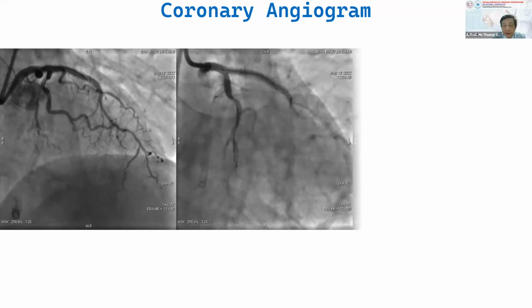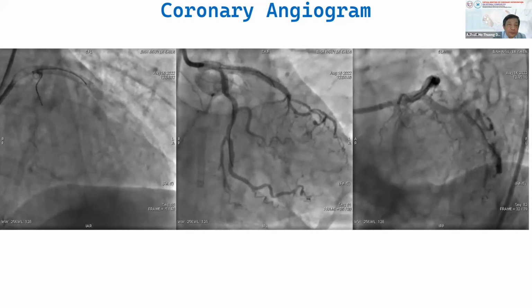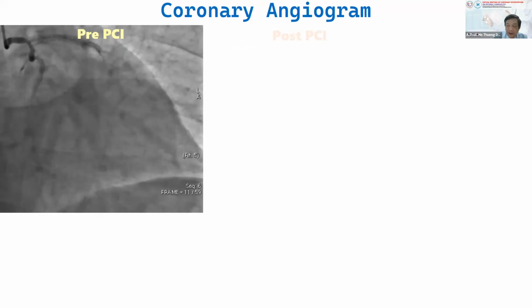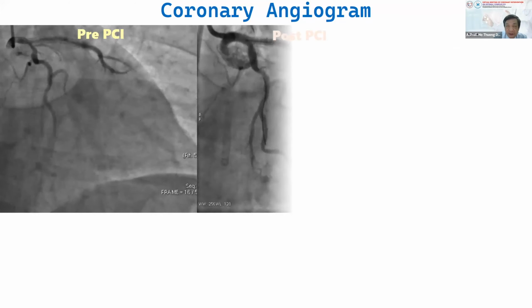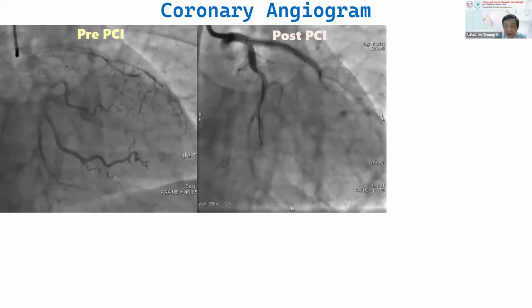And we did a recall of the IVUS. The IVUS catheter did not go distal, but only to the mid segment of the stent. But the result is very good, but the file is not good, so I cannot show it here.